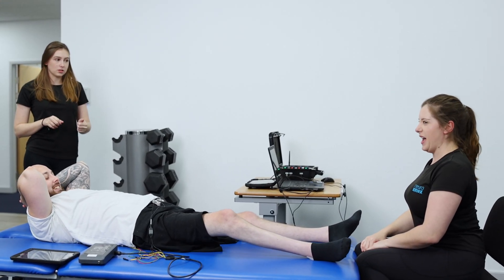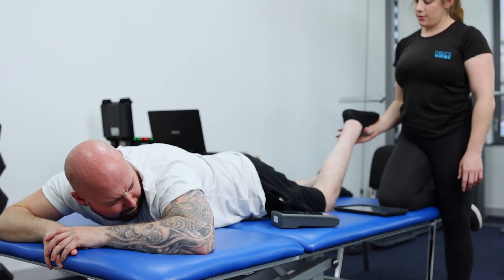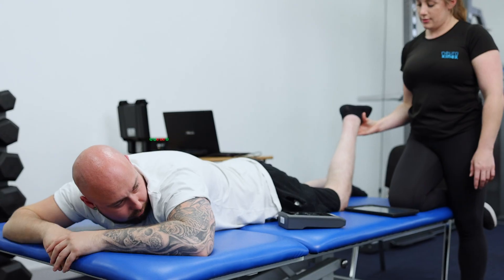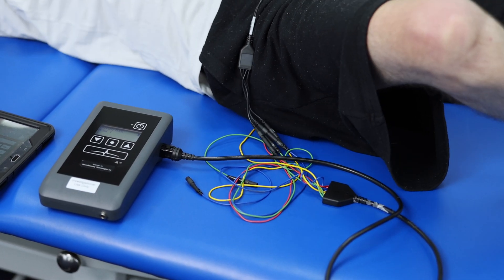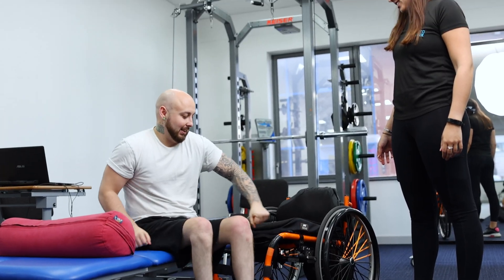Anything can happen if you put your mind to it. One of the benefits I got back from the stimulation is being able to lift my leg and move it around. Being told that I'd never be able to move my legs when I was in hospital, this is quite a big achievement for me.